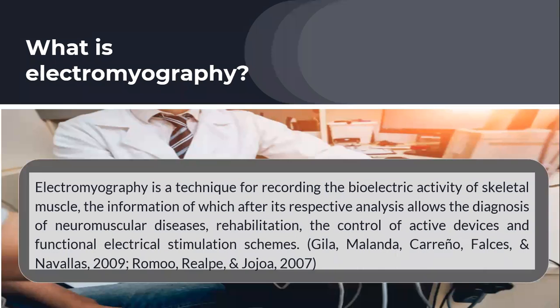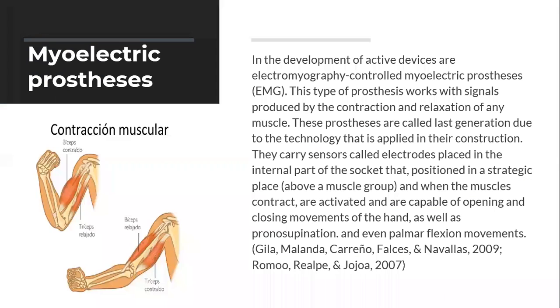What is electromyography? Electromyography is a technique for recording the bioelectrical activity of skeletal muscles, the information of which, after its respective analysis, allows the diagnosis of neuromuscular diseases, rehabilitation, and the control of active devices and functional electrical stimulation schemes.